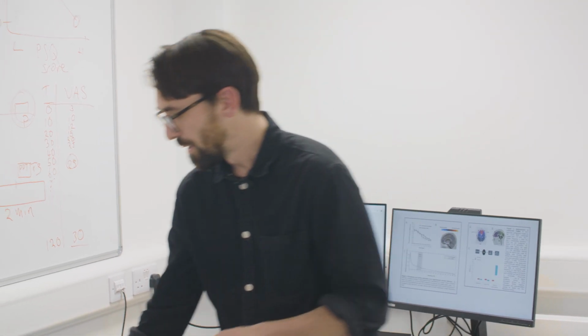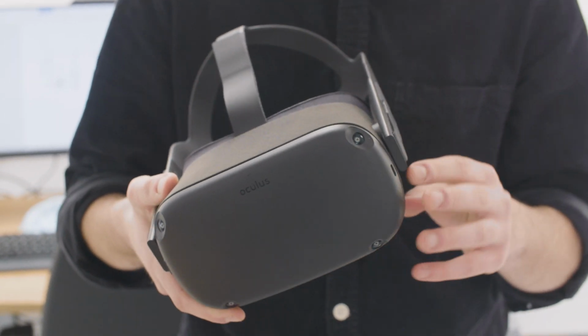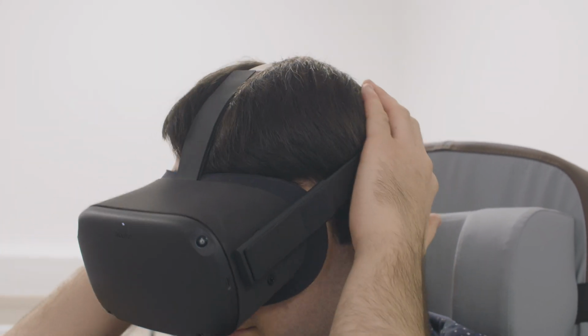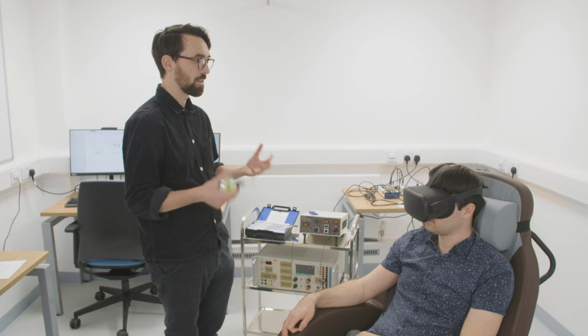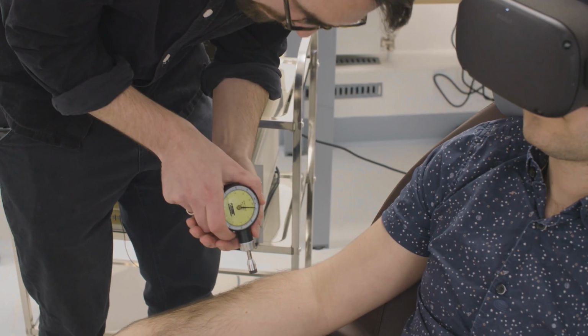So this is the virtual reality headset that we use, and I'm going to ask my participant Daniel to put this on. What we're particularly interested in is to see whether or not this experience can change the way Daniel perceives the pain. So I'm going to do exactly the same thing that I did last time, Daniel. I'm going to ask you to tell me when this transitions into an aching sensation, okay? Yeah, okay.